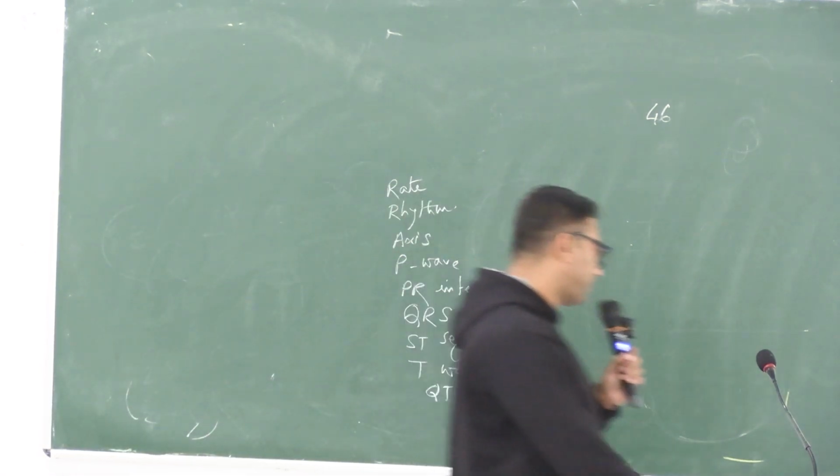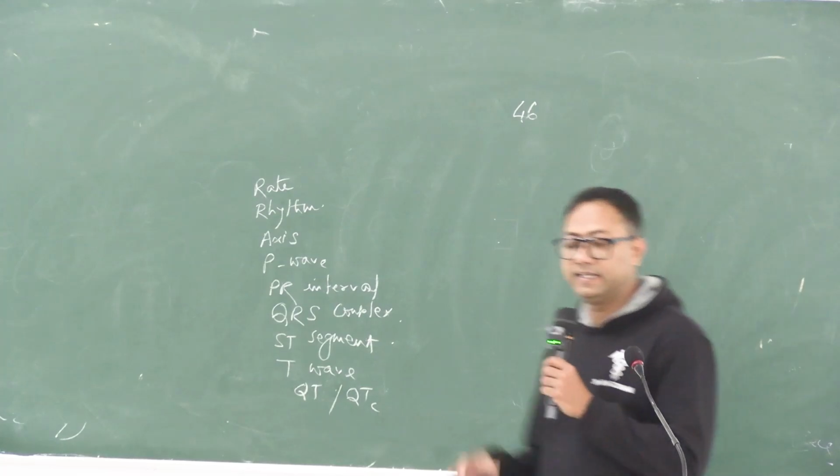Okay, so these are the parameters that we see in an ECG.